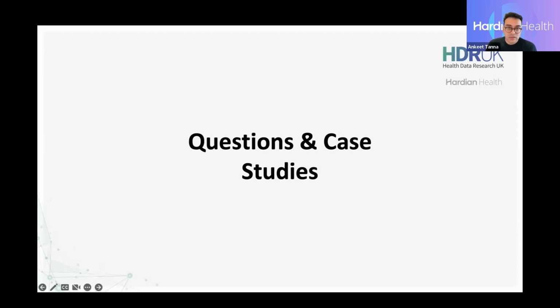Secondly, I think it is quite a nascent space. So, as time progresses, we'll probably be able to see more information come through. And that links to the third point of the increased importance that's now being placed on real world evidence, which you discussed briefly a few minutes ago, particularly in the case of AI, where you want to think about performance drift and variability across sites. And I think the trouble is at the moment, infrastructure to collect solid real world evidence in a post-market setting is tricky.